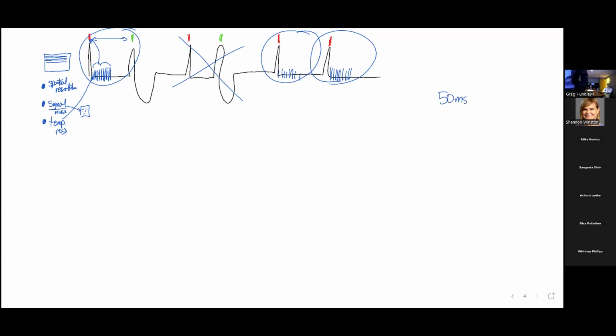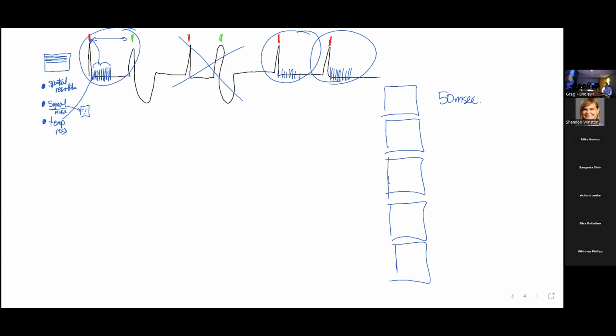right? So can we come up with a way, with our cine movie over here, remember this guy? We've been averaging, right? We get one piece of information here, here, here, here. What's nice is our cine movie is collected over the 10-second breath hold, and so we get that intrinsic averaging.